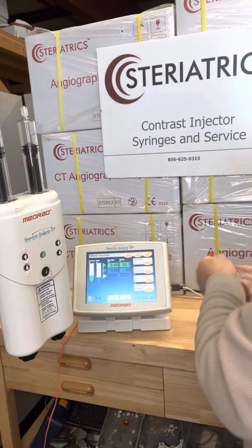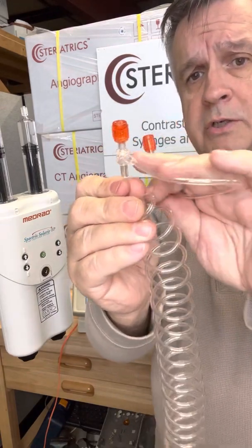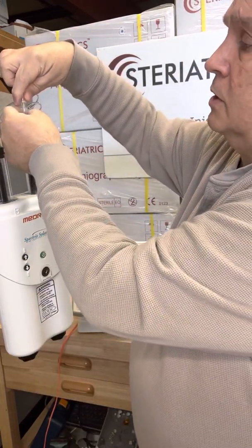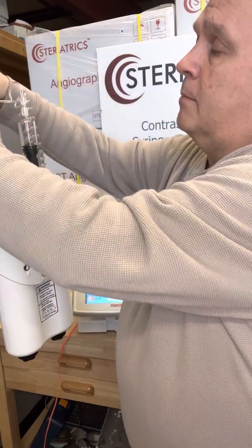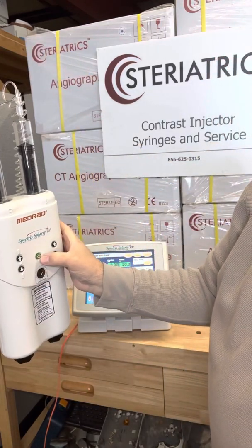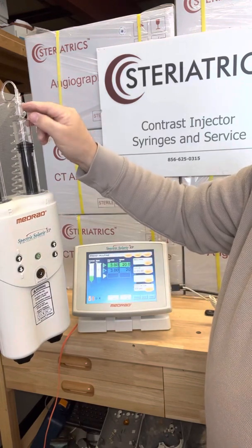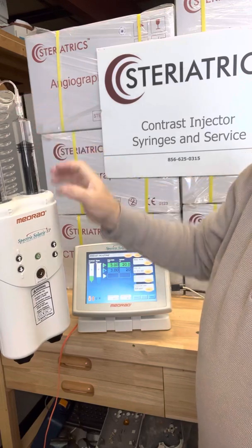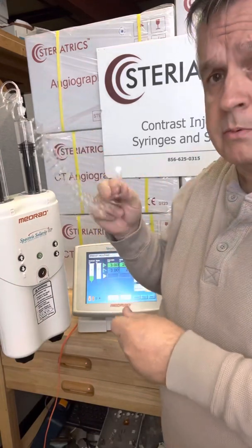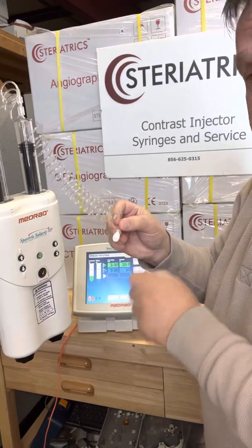Now we're going to put our tubing on. When you look at the tubing, you'll notice it's a T tubing — the short side is going to go to contrast so we don't waste any of that, and the long side goes to saline. Take the dust cap off, put this on. What's nice is you can turn the collar and get it into position. Then come over here and do the same with the B side. To expel the air, press the enable button — that green enable button — and it's going to allow us to run up. Run it until the contrast goes above the T area. Then take enable again, take our saline and run that down and dribble it out. We have a dust cap — we can dribble through it, so not a problem.